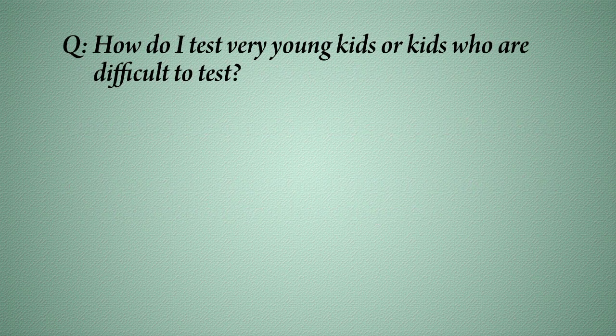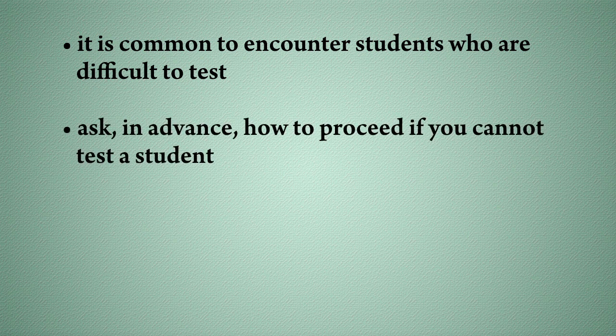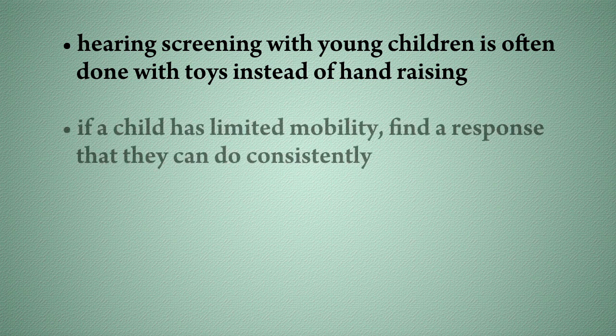How do I test very young kids or kids who are difficult to test? It is common to encounter students who are difficult to test. Be sure to ask the educational audiologist or your supervisor in advance regarding how you are to proceed if you cannot test a student. It may be necessary to refer the student to an audiologist for further testing. Hearing screening with young children is often done with toys instead of hand raising. If a child has limited mobility, find a response that they can do consistently to indicate that they heard a tone.